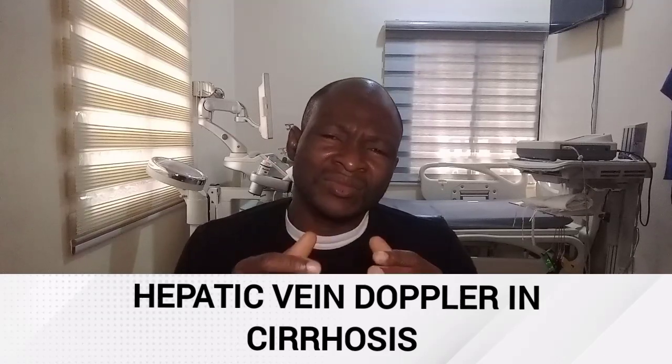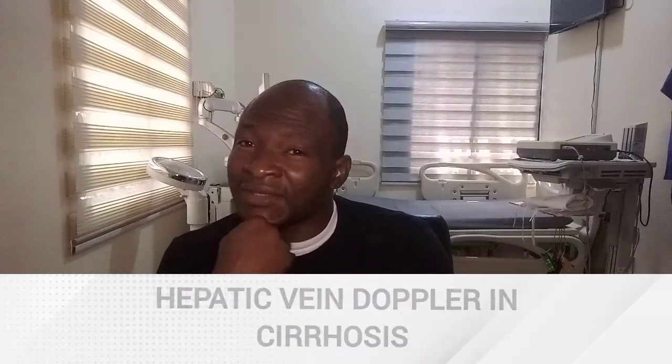Now, Doppler of the hepatic vein in cirrhosis. In duplex Doppler imaging of the hepatic vein of patients with cirrhosis, the normal triphasic pattern of the hepatic vein may be lost and show a monophasic waveform, probably because of decreased compliance of the vein secondary to fibrosis and steatosis in the parenchyma surrounding the hepatic vein. This may be the earliest sign of cirrhosis in about 75% of cases.